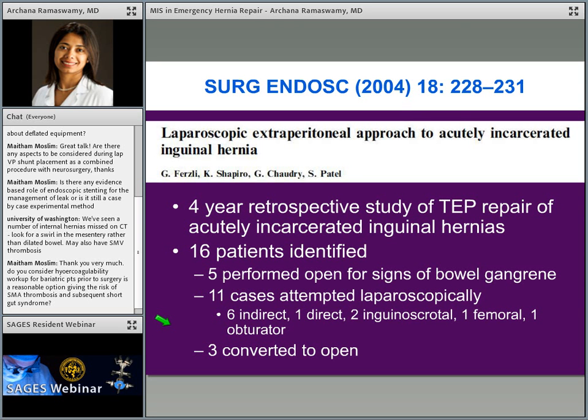This is a little Richter's hernia from a port site. Amazingly enough, I've even seen them with 5-millimeter ports, even though we say that we don't see hernias after those, we do. CT scan showing a small Richter's hernia. These small hernias which are incarcerated are the ones that are really fabulous to approach from a laparoscopic fashion, especially in some of the larger people.